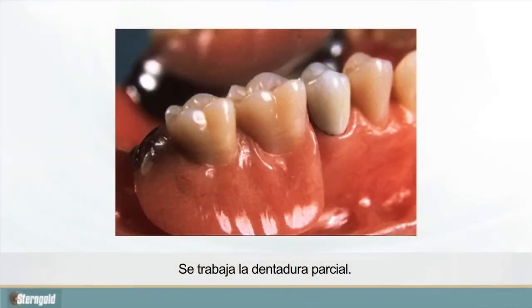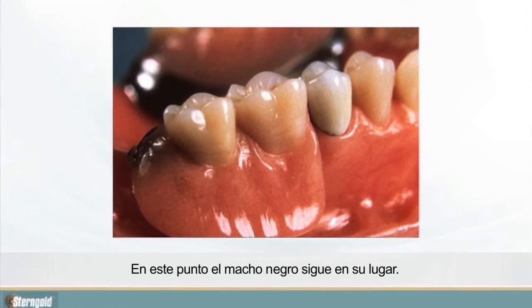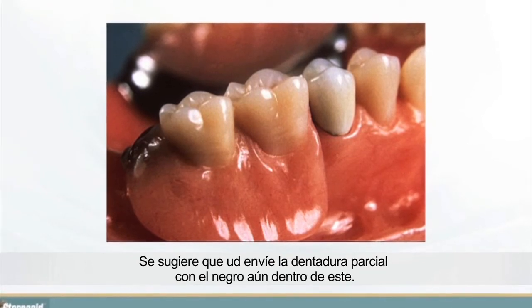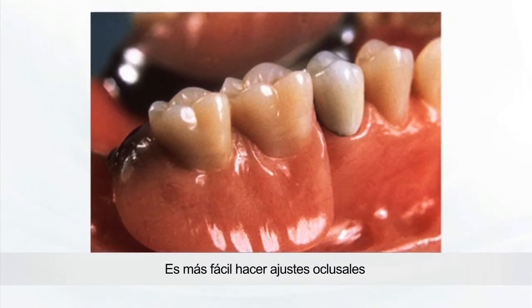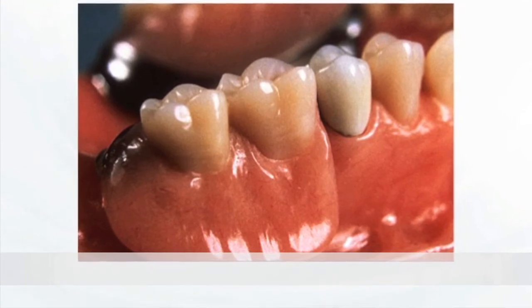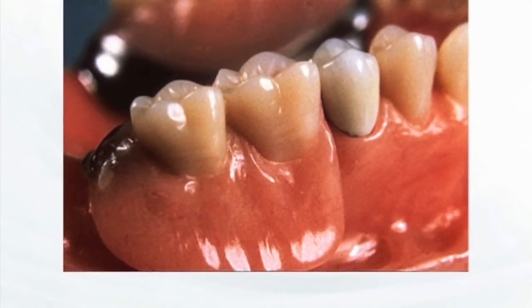The partial denture is processed. At this point, the black male is still in place. It is suggested that you deliver the partial with the black male still inside the partial. It is easier to make any necessary occlusal adjustments without the partial moving. With the black males in place, the partial is non-resilient.